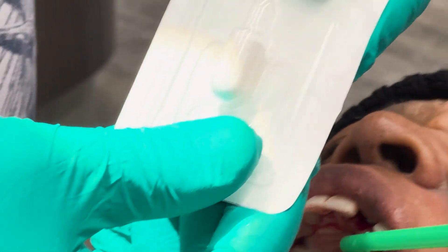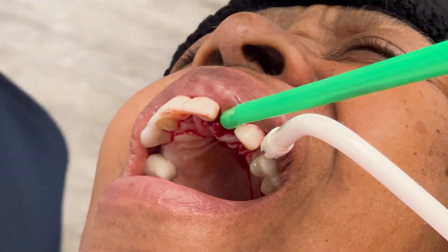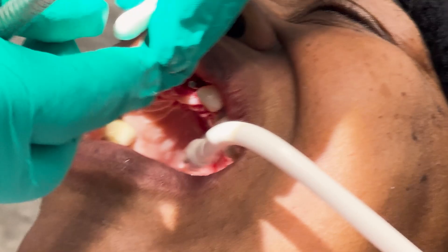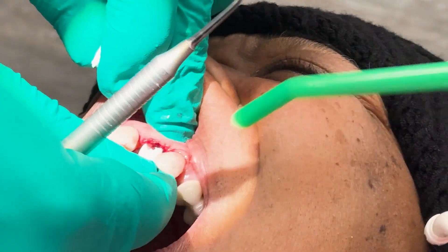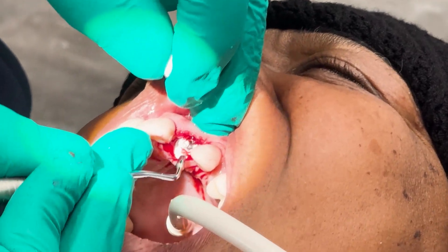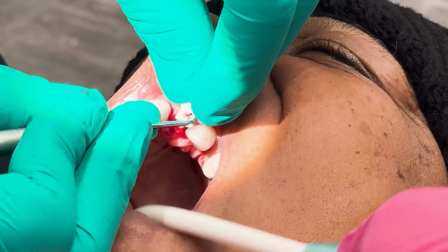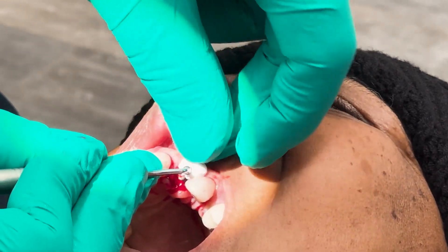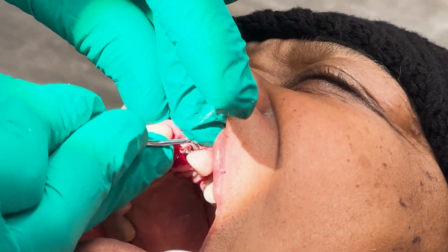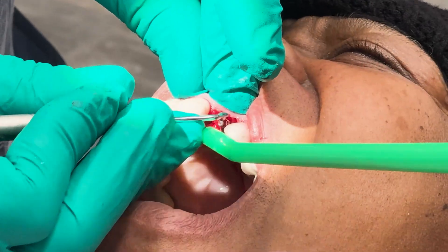We're going to be using our new Shacken First bone plug, which we're going to be launching very soon — so stay tuned to the new Shacken First bone plug launch coming in the next week or two. We're going to pack all around the implant. This is a bovine collagen bone plug and we're packing all around the implant. This is a fantastic product that we've been using in my office for several months now and I really like it. I always use a product myself for a while before I launch it and introduce it to all of my friends out there.